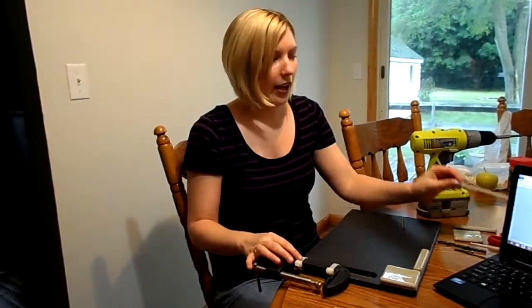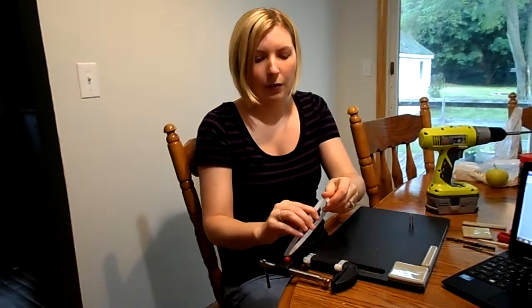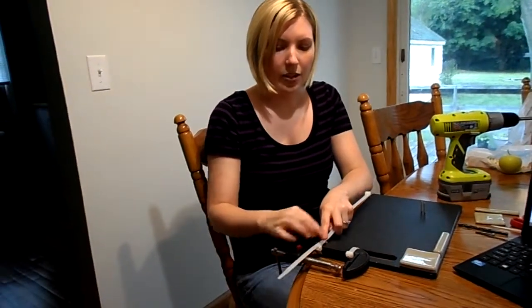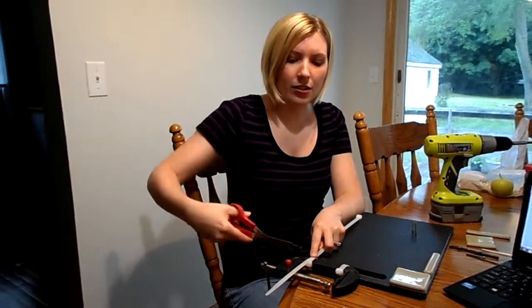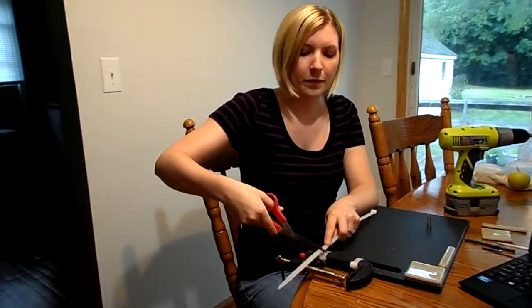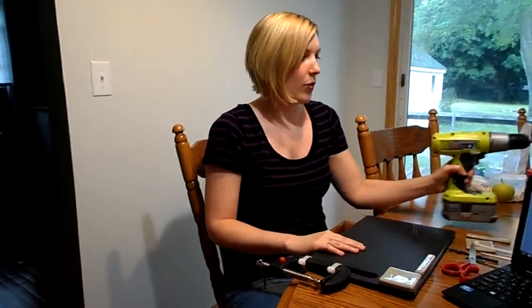And then once you're done with that, you can just go ahead and place your second zip tie through the hole and around the clamp and secure it tightly. And then you will have about this much zip tie length left over. So you would just go ahead and take your scissors and cut the extra length of the zip tie off. And now your cutting board is complete and ready for use. So I will show you how to use it making apple slices and crackers with peanut butter.